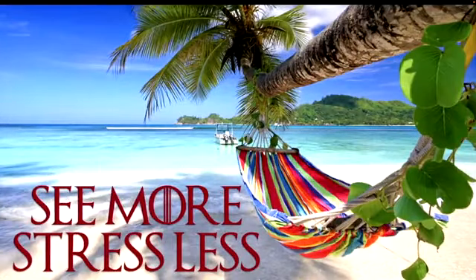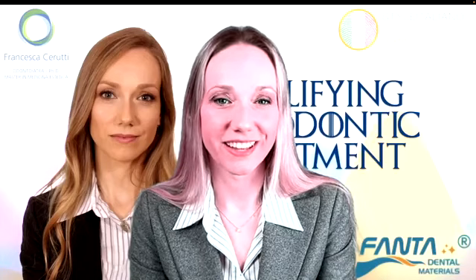So the take-home message is see more and stress less, because every time we can do something that improves our vision in dentistry in general, but in particular in endodontics, think about the loupes or the loupes associated with the light, or better with the operative microscope, everything that allows us seeing better puts us in a position of advantage and allows us doing a better job in a shorter time and with a lot more confidence and with less stress. So I think that will make our life extremely easier.